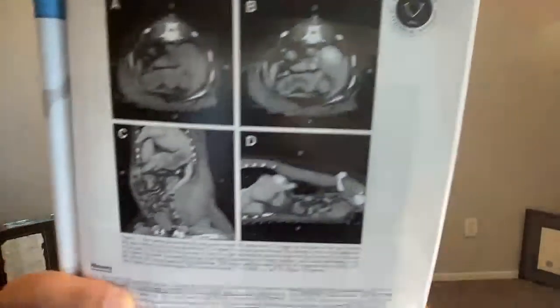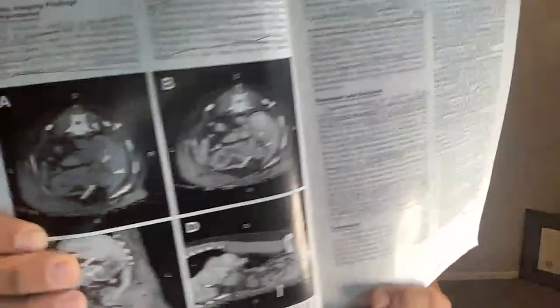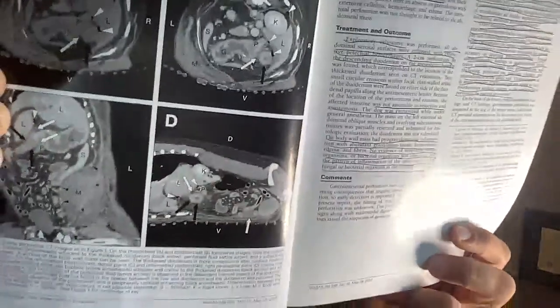So the dog started getting worse over the next 10 hours. They performed an abdominal CT, or computed tomography, and here are the images for those who want to pause the video and look. They also have a deeper explanation of the CT scan right there, and we'll try to go through it.